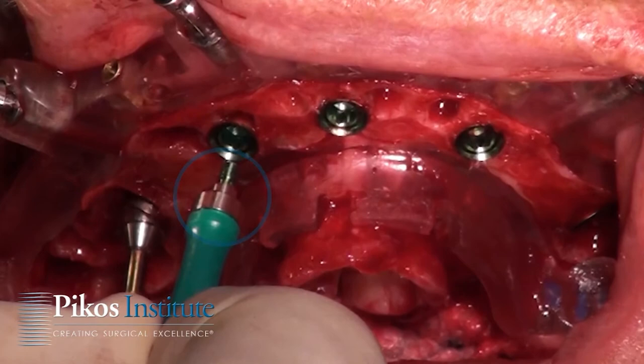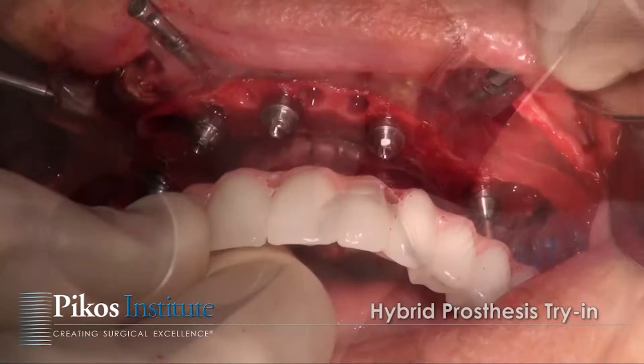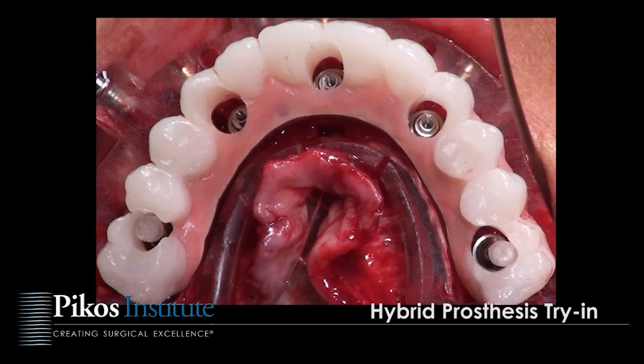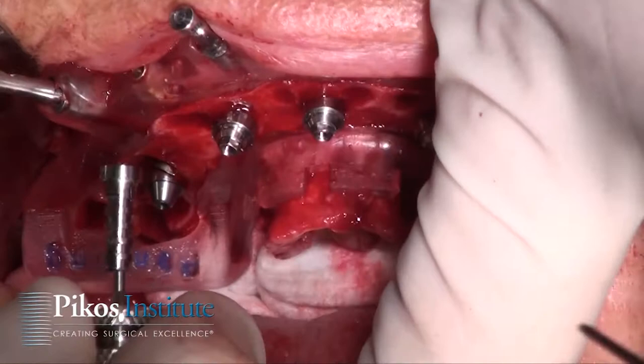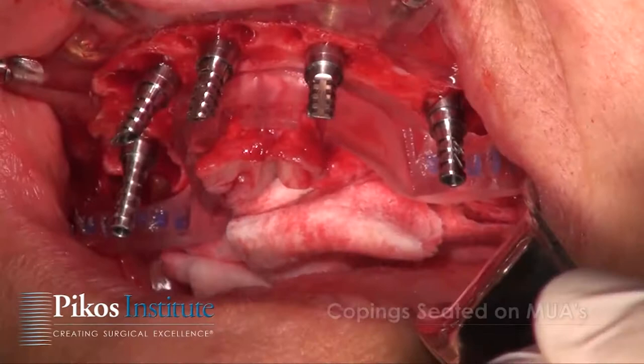With each multi-abutment we're placing this prefabricated prosthesis, just making sure we have good draw. We torque down the multi-abutments to the appropriate newton-centimeters — in this case 30 newton-centimeters for this BioHorizons system. We then use the copings, which are pre-selected and cut to size, saving more intraoperative time. Reduced intraoperative time is a huge advantage of this approach.